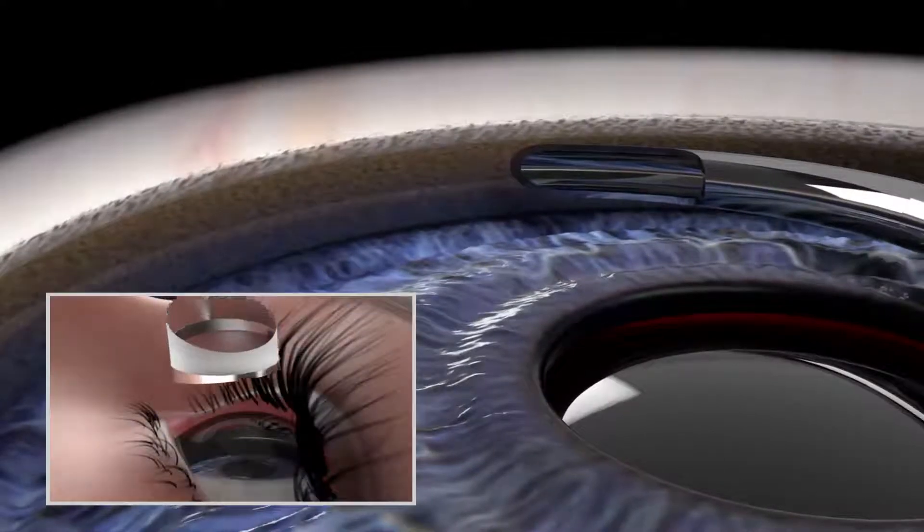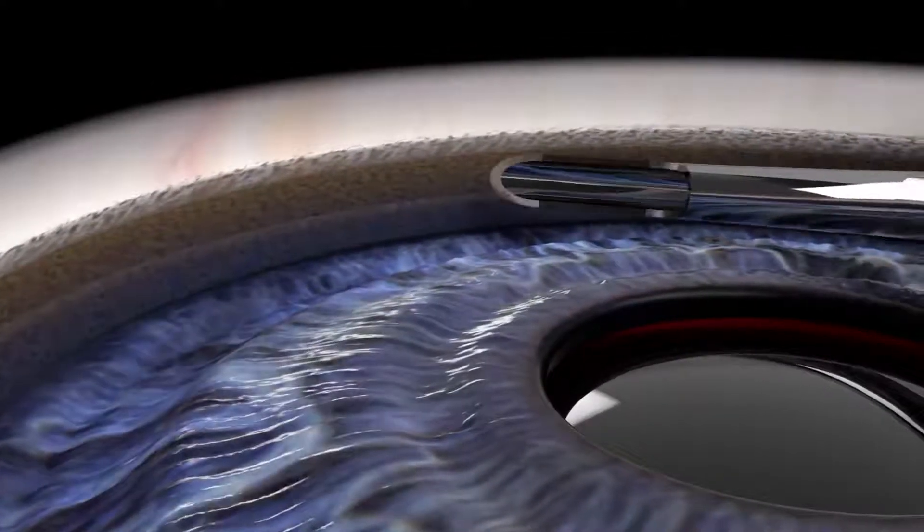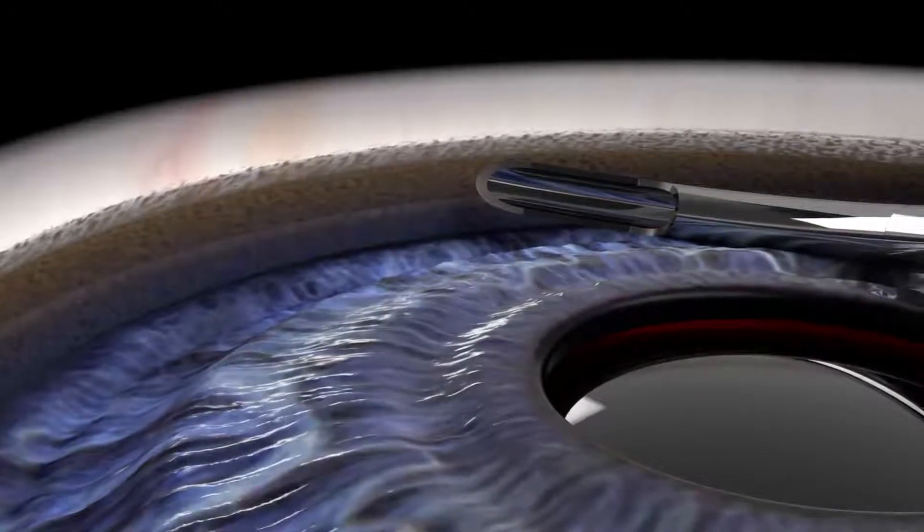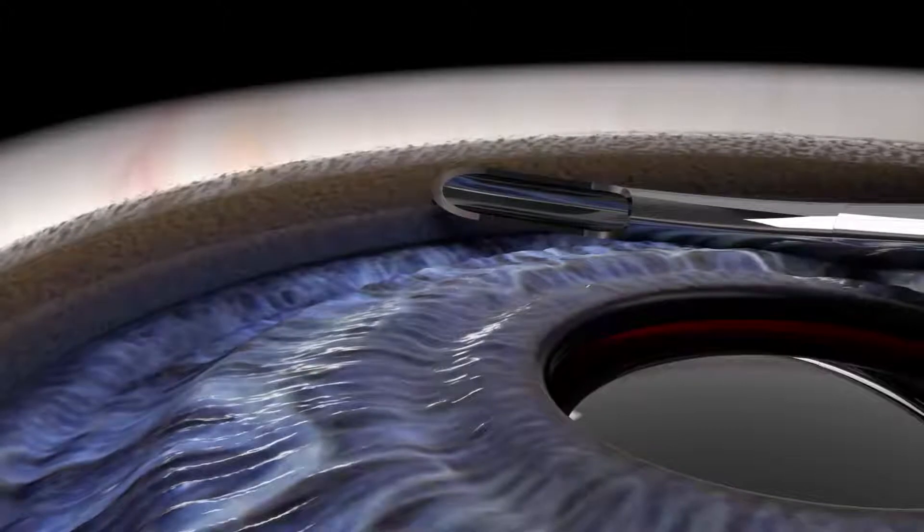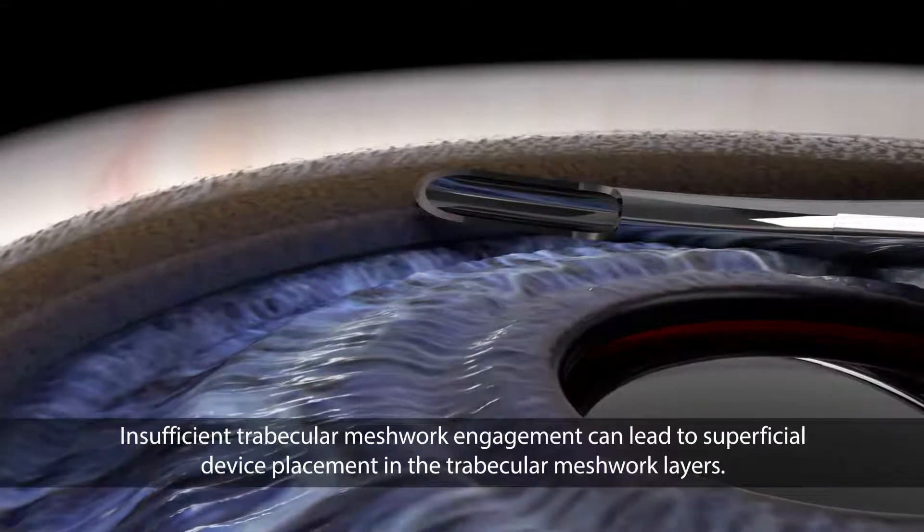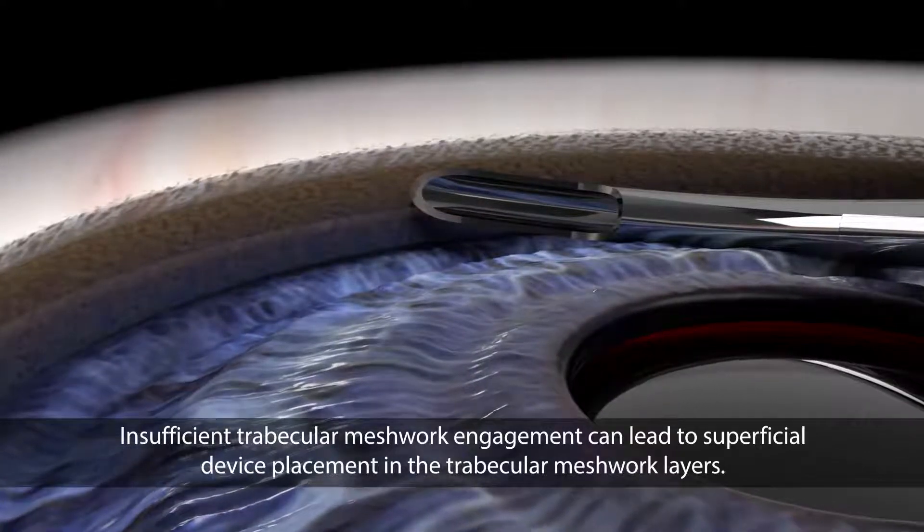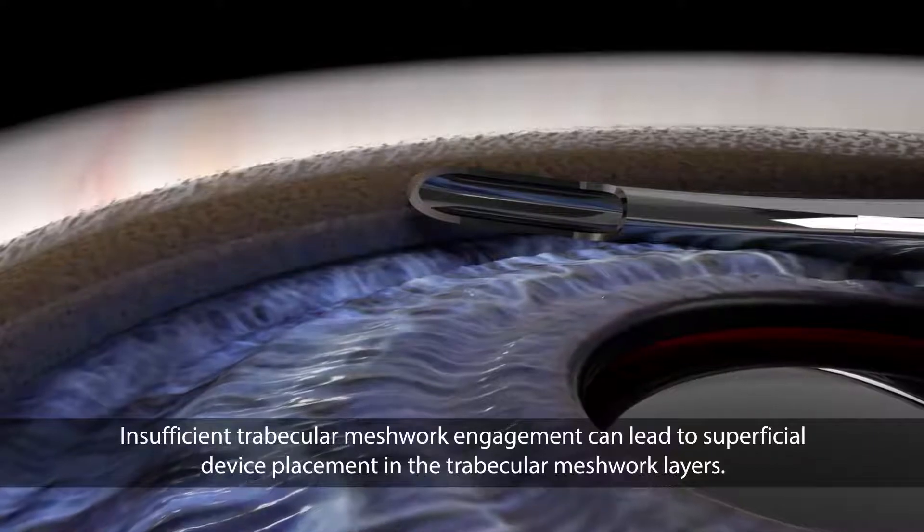Under gonioscopy, the beveled tip of the cannula should be tilted up approximately 15 degrees and then used to access Schlem's canal through the trabecular meshwork just above the scleral spur. Please note that insufficient trabecular meshwork engagement can lead to superficial device placement in the trabecular meshwork layers.